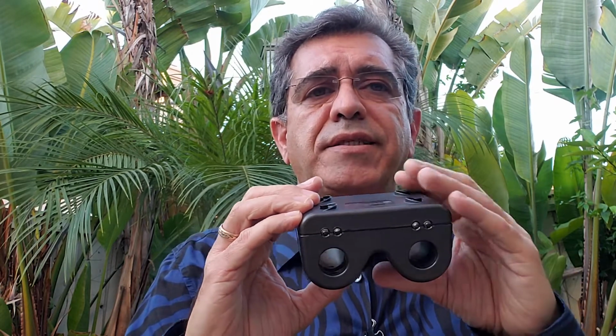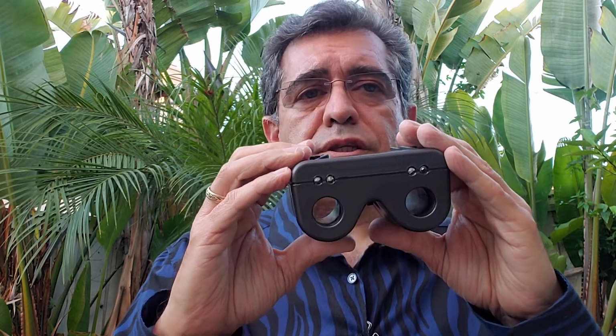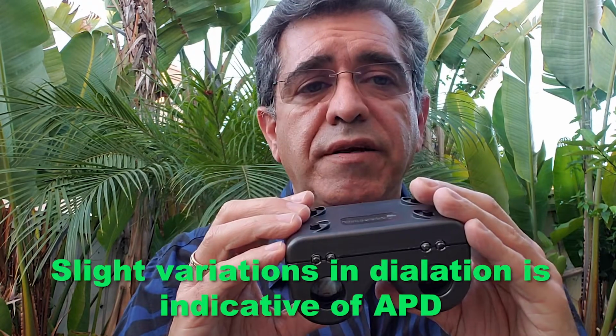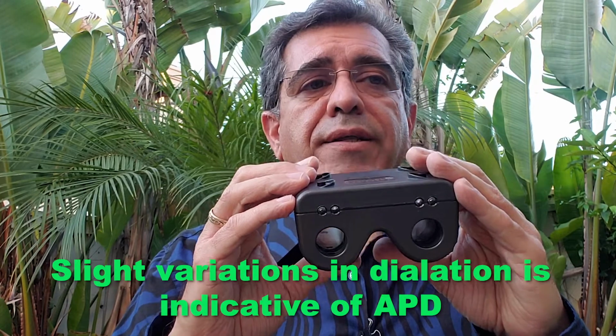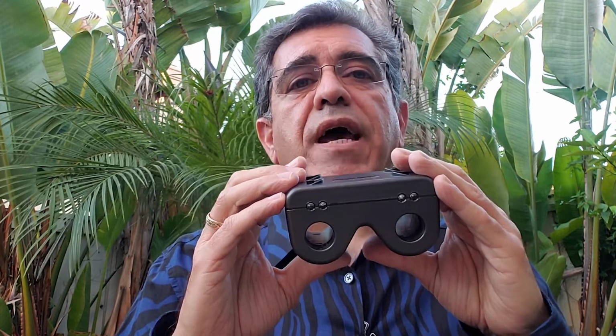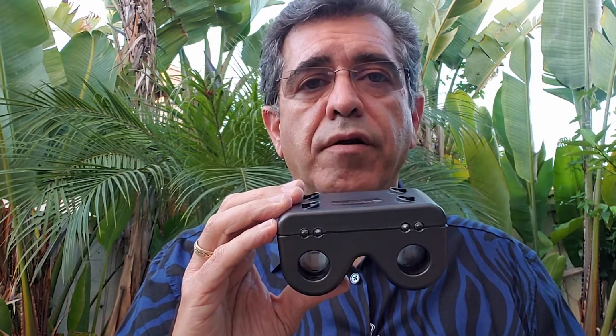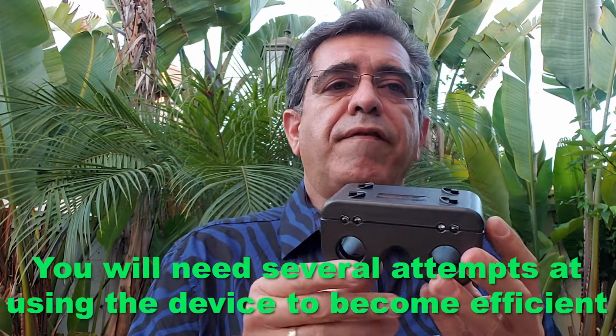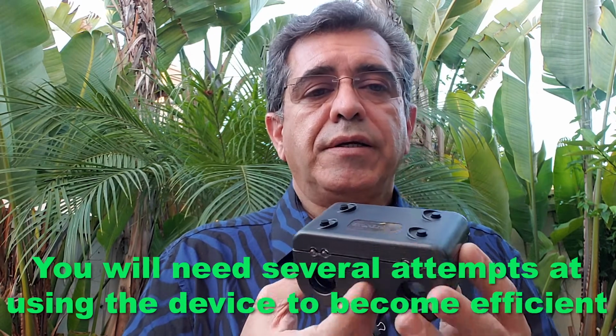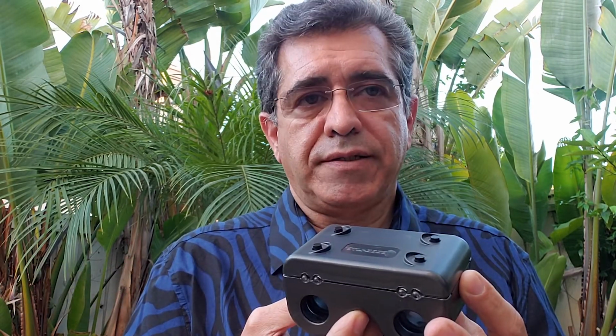If you happen to see one pupil dilate slightly after you switch the light, that would be a positive APD. It would mean that eye that dilated must have an abnormality. It's either in the optic nerve or a significant portion of the retina. It really does take 5 or 6 trials to get a hang of this device.